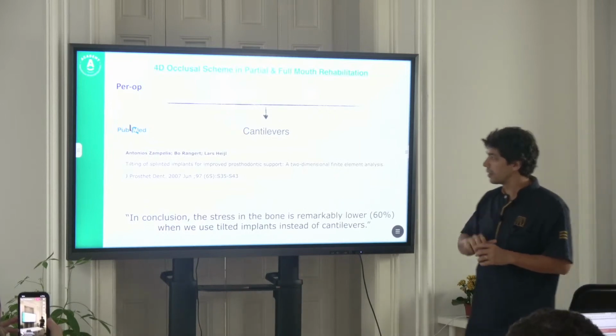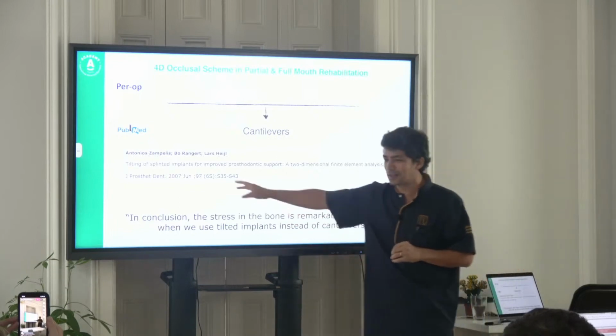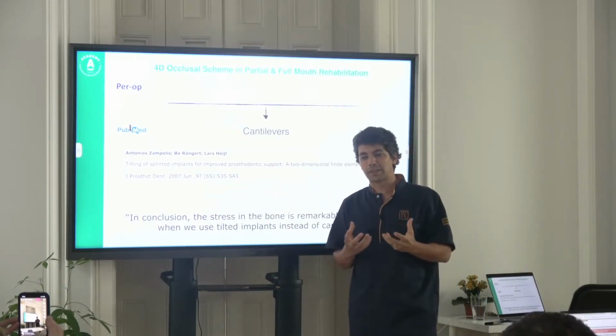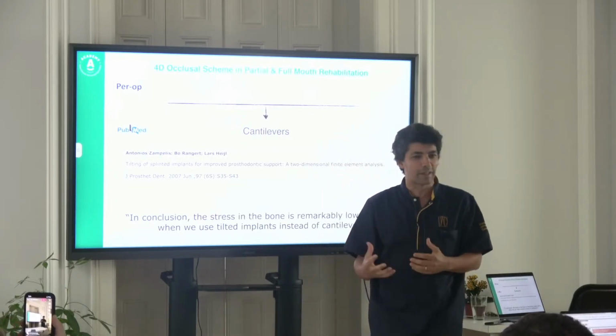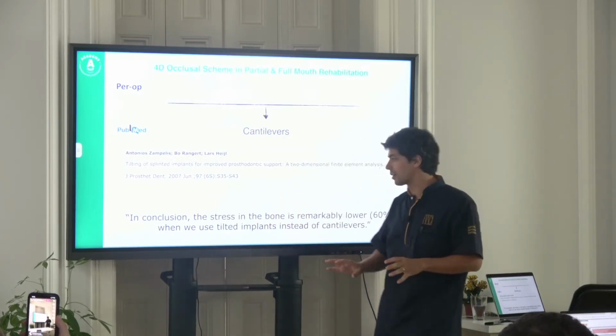Then I bring up another article that was written at that moment, in 2007, to try to answer a big discussion related to cantilevers and tilted implants, etc. But let's point out what is important for us in this article.